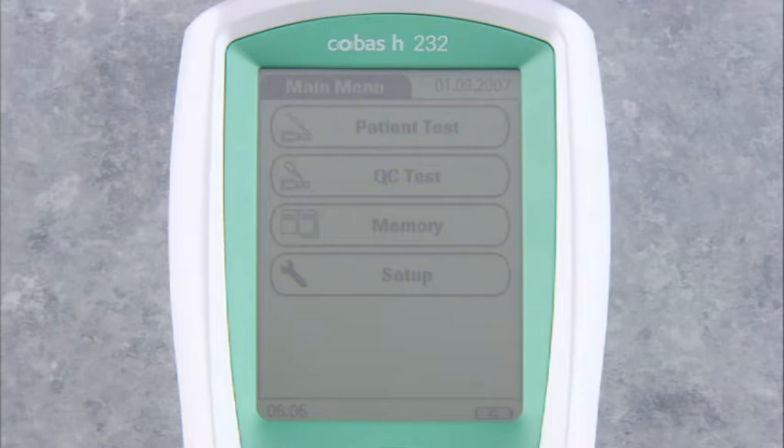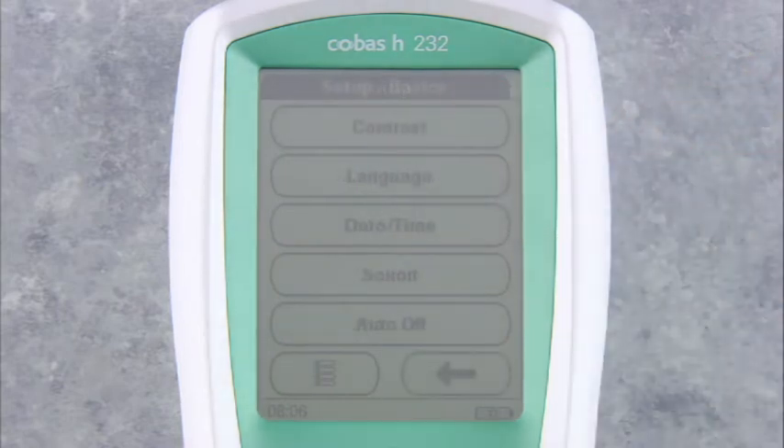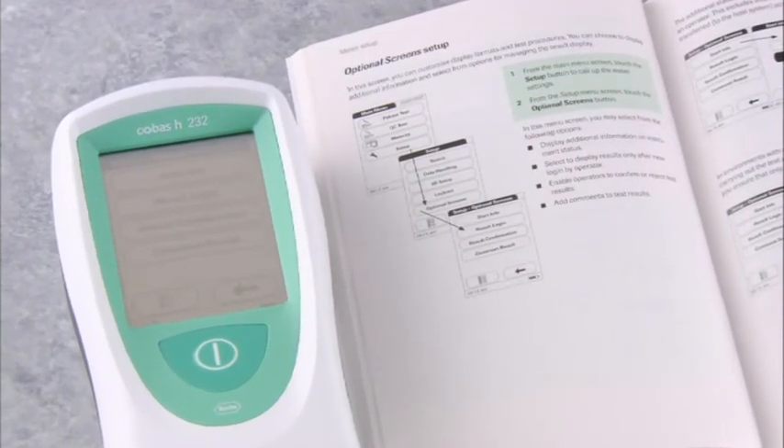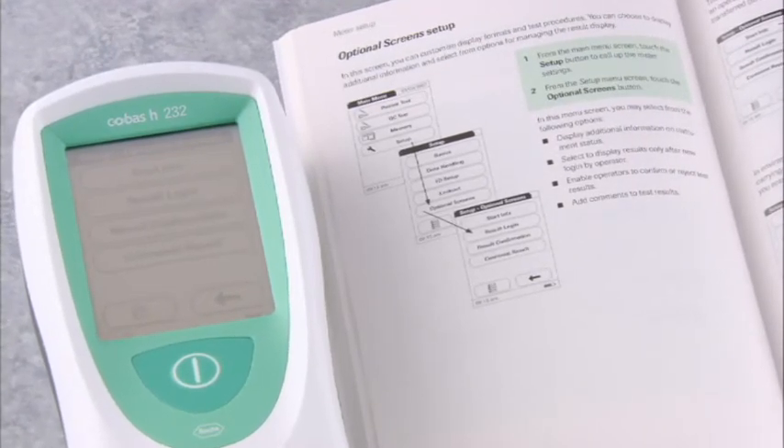At any other time, you can return to date and time by first touching Setup from the main menu, then touching Basics, then date and time. The Cobas H232 meter has additional setup parameters that will allow you to customize the meter to your facility's specific requirements. For more information on these additional setup parameters, please refer to the operator's manual. Note that in general, there is no need to change the setup during routine operation.